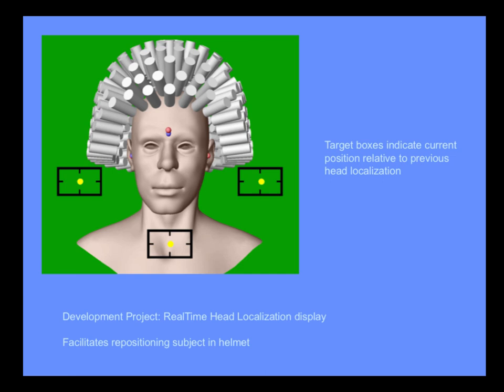So although we don't have to do this because we can transform spatially the coordinate system, it's better if you have the same coverage. That is, it's better if the person's head, with respect to the coils, is in the same spot, then you know you've got the same coverage and you're not going to introduce anything.